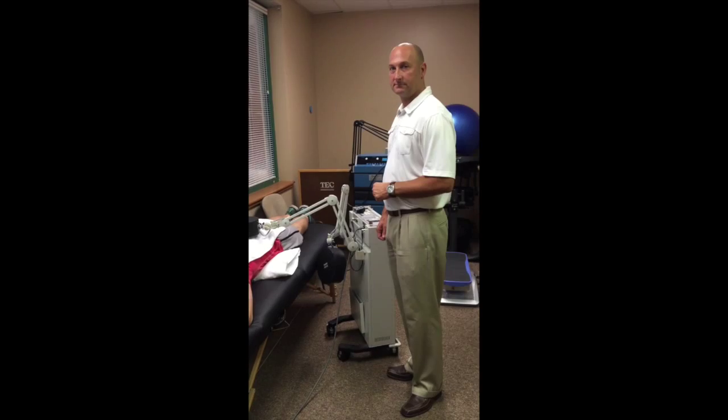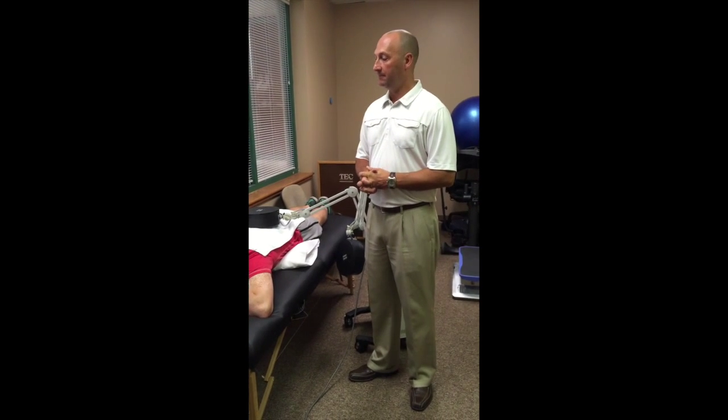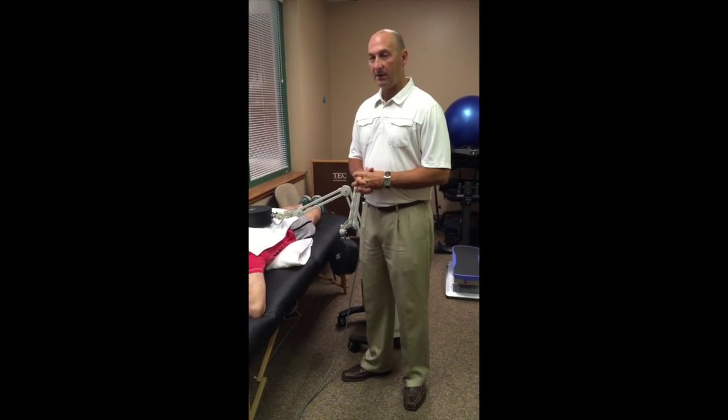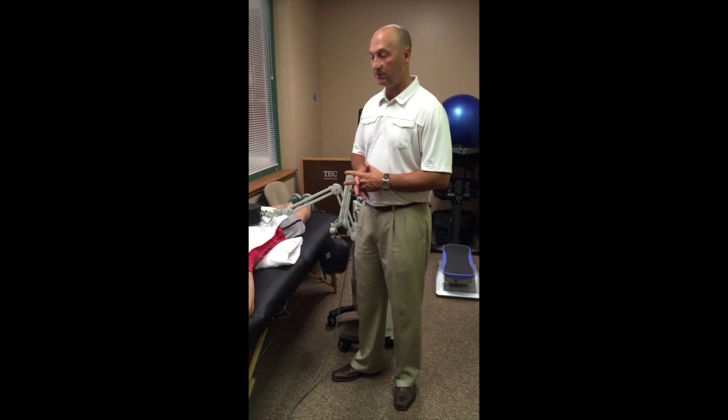So next we will have a volunteer as a patient, and we will go through the setup of each one of these units. So before we initiate treatment, I always like to, with my patients, at least go back through one more time and make sure that we have covered all of our contraindications or precautions that we might have with the use of any of the modalities that we are attempting to use.